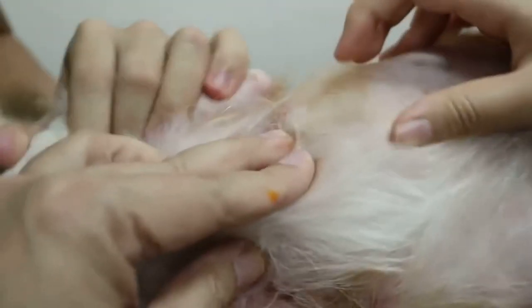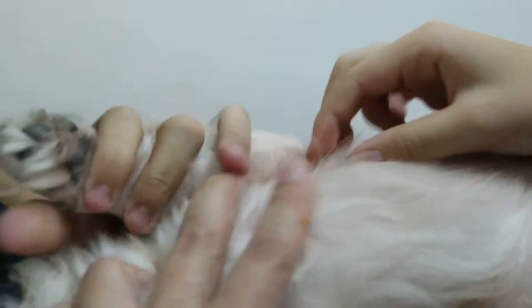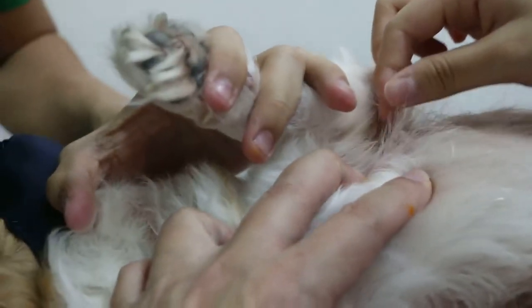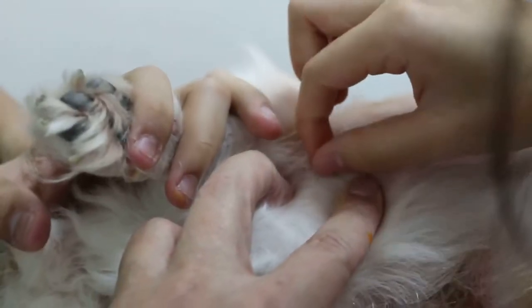The tape not ready. Okay, just put on one side and then look for another area. Same tape, same tape. Just look for another area. Now we took this area — which area? We took this side, the edges here. You must know how to hold the dog. Just the edges — pluck a few hairs and quickly. Don't take your time, just pluck that.